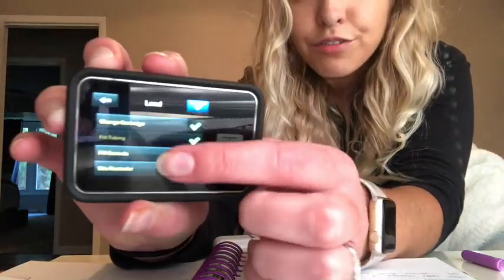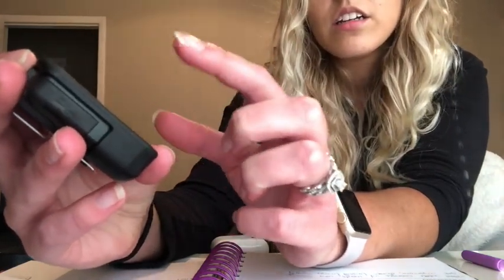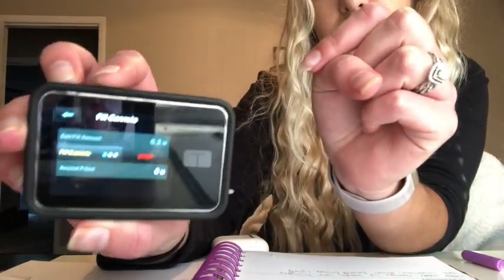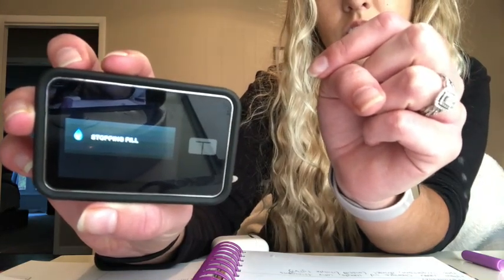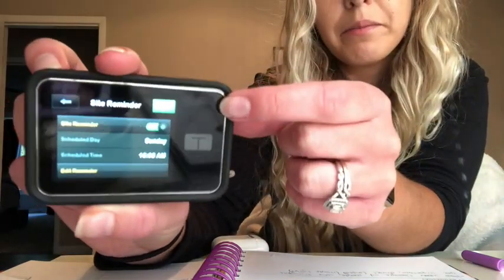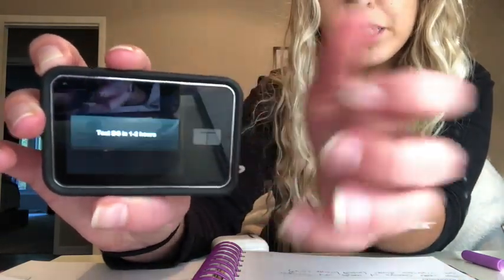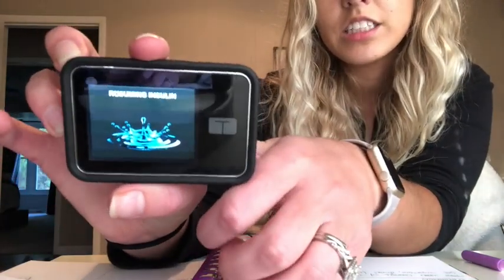And then there's an option to fill cannula. So I'm gonna hit that. And then I'm going to hit start to fill the little piece of tubing that's under my skin. Okay, so then it reminds me when my next site change will be. And then all of my check marks are there, so I go ahead and hit the blue check. It says test your blood sugar in 1 to 2 hours, and then it says ready to resume insulin, and I hit yes, insulin is resuming, and I am back.